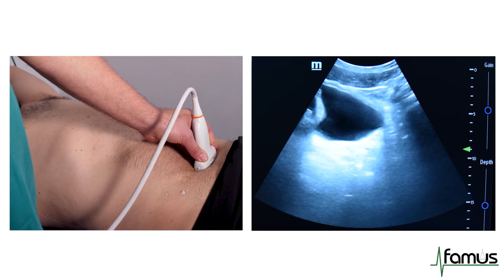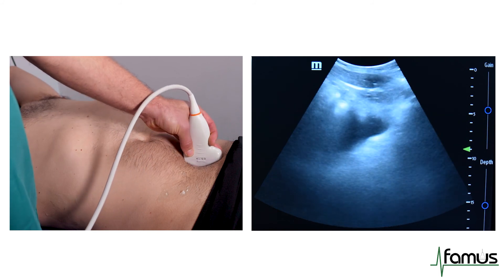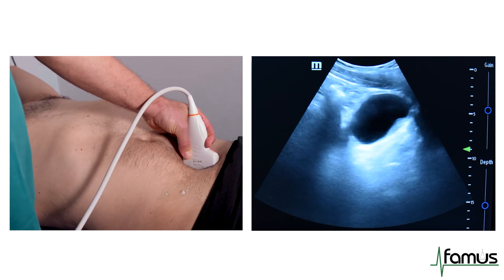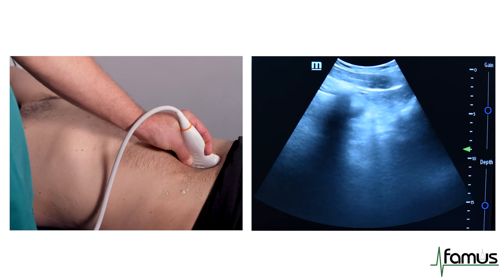We then rotate our probe into a longitudinal fashion with the marker dot going towards the head. And again, we tilt our probe from right to left to see where the largest bladder volume appears.